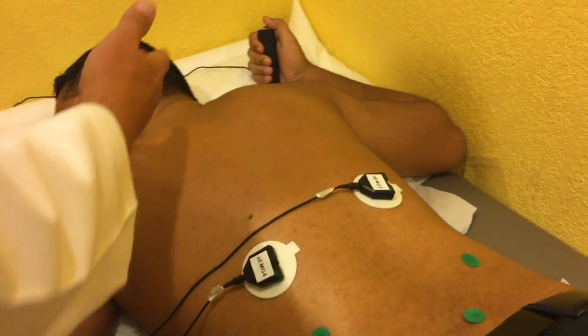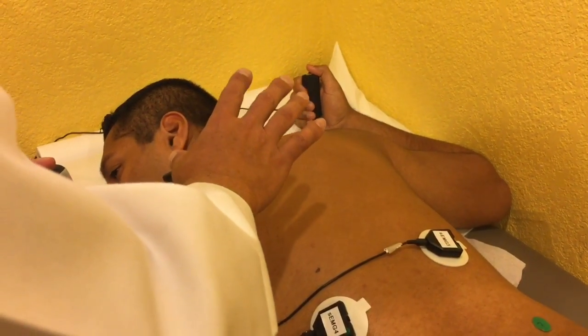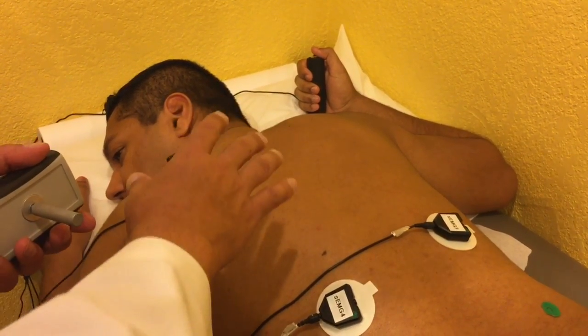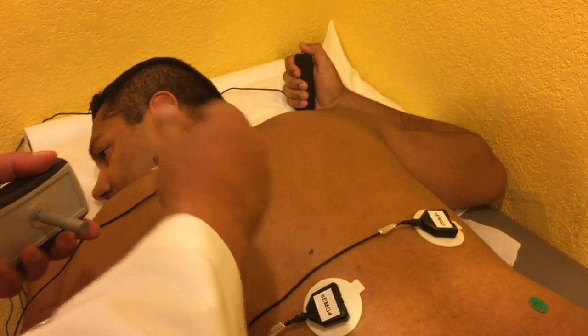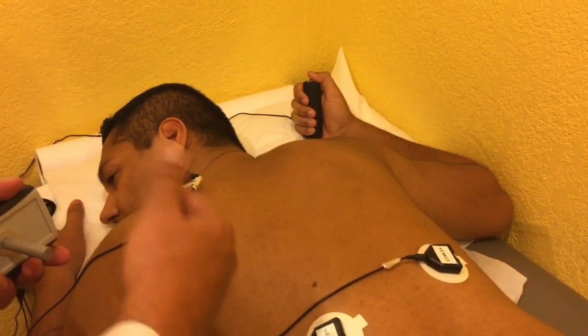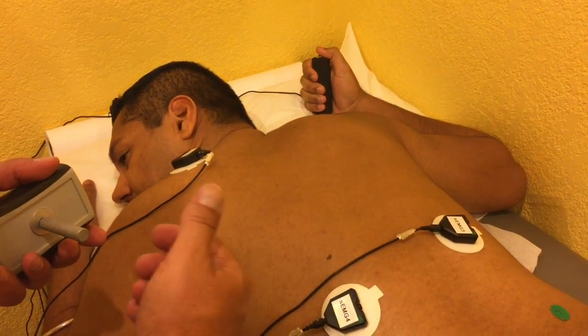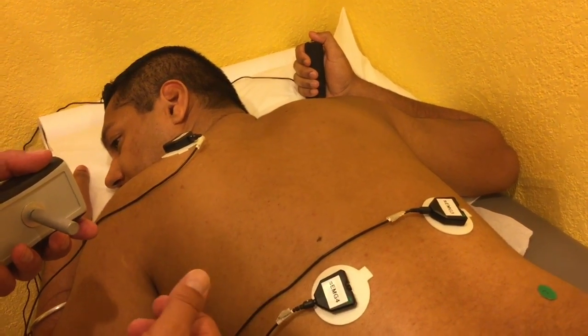Make sure you have instructed the patient on appropriate time to trigger the response. We don't want the patient to wait until it's extremely painful. We're not measuring how much pain they can tolerate. We want to measure when they note onset of discomfort or pain. They need to be consistent throughout the test.